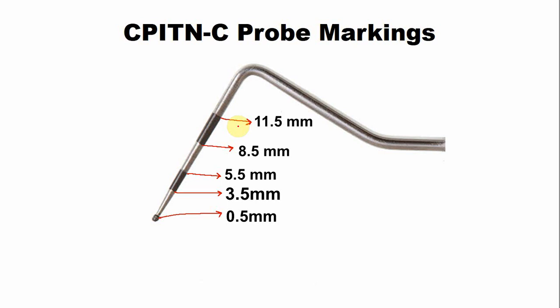The probe is usually made up of stainless steel, so it can be reused again and again after proper disinfection and sterilization.